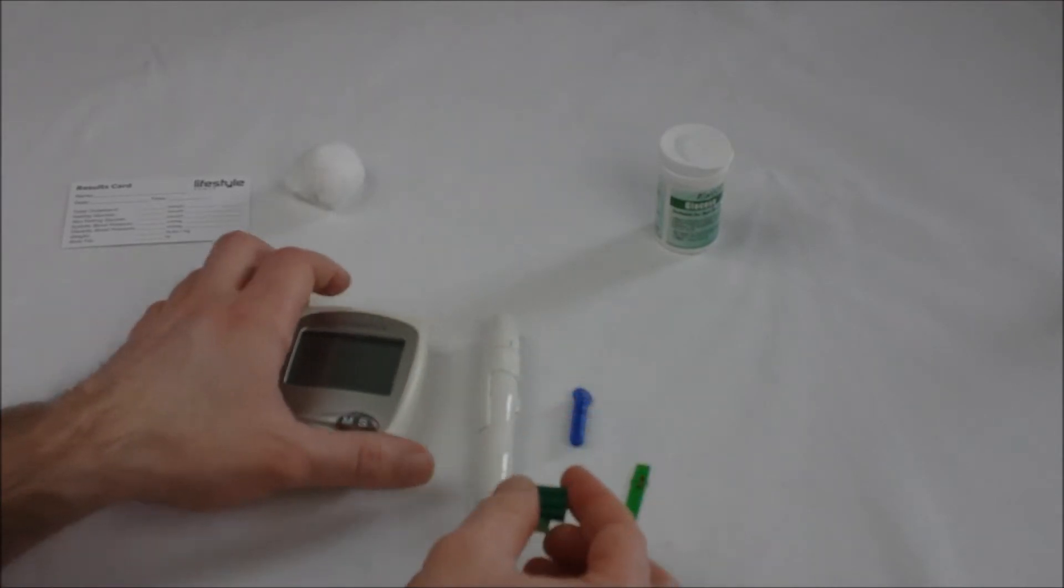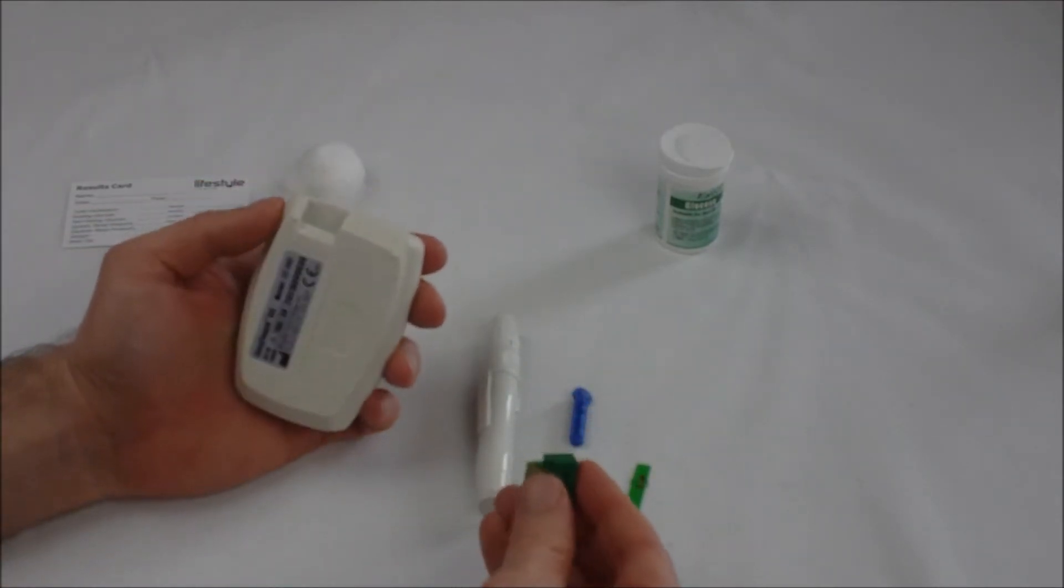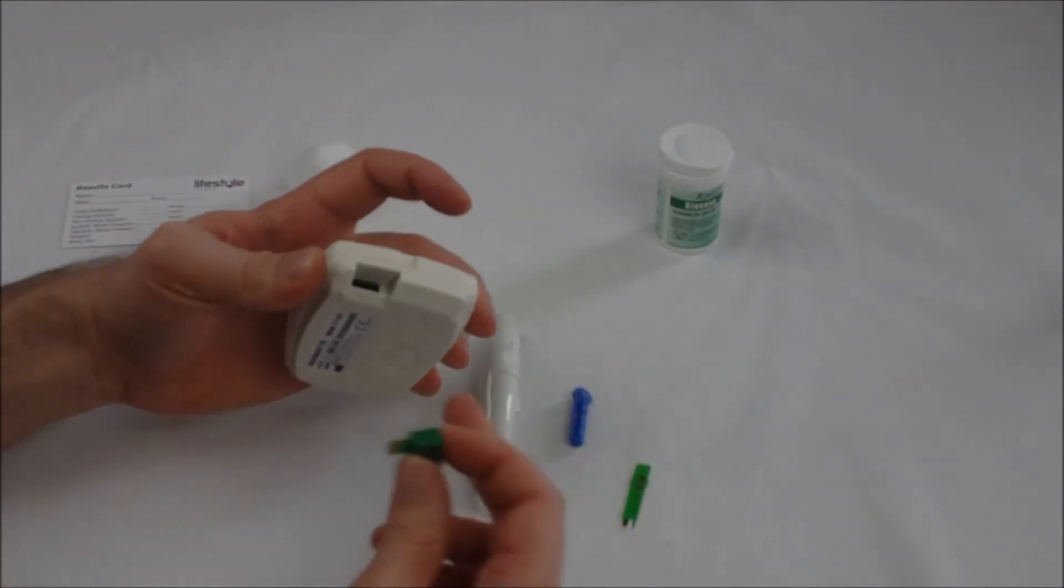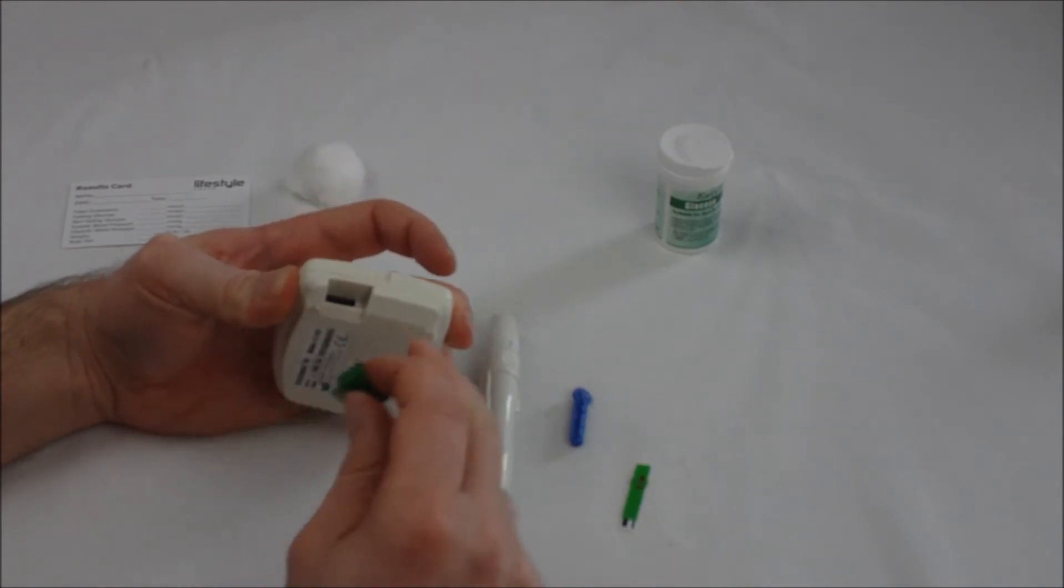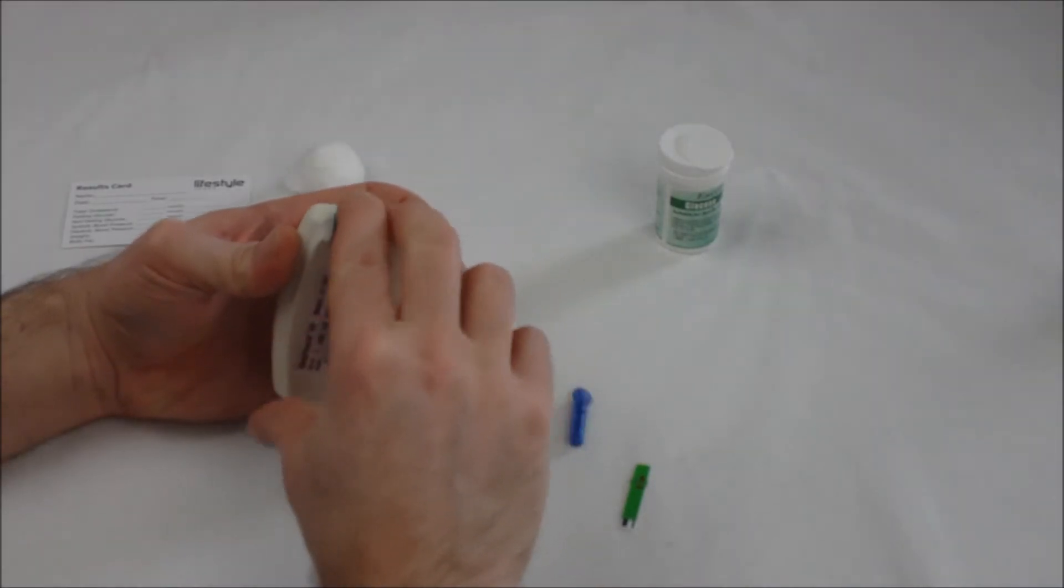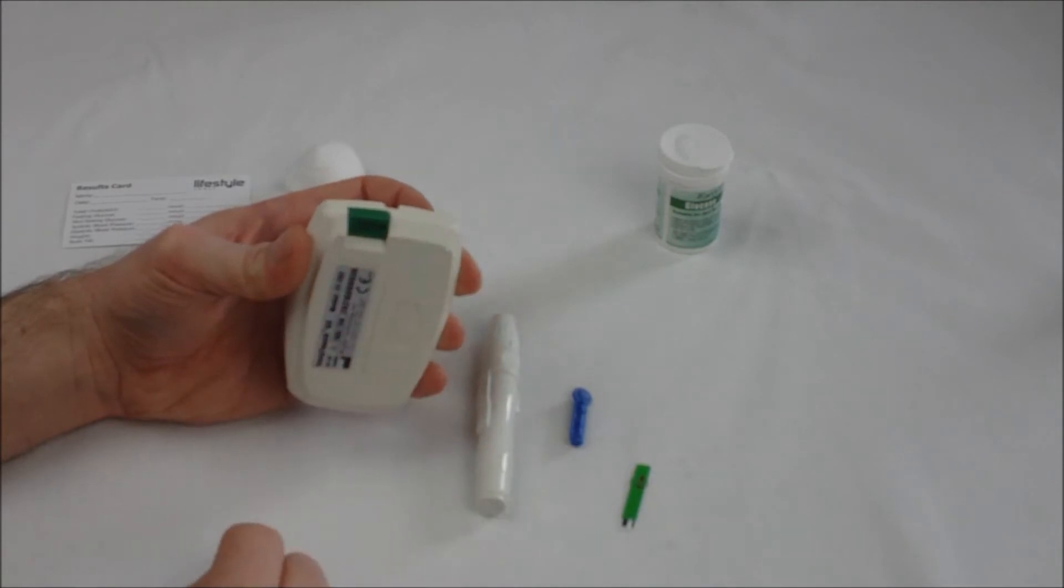This code key tells the monitor which test strips you're using, which batch. The code key goes into the slot at the back of the monitor and it will only fit in one orientation. You just want to be quite firm and slot it into position.